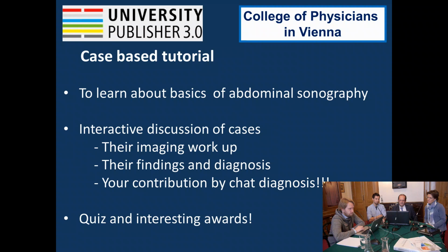Well, interactive discussion of cases: we will concentrate on the imaging workup of findings and diagnosis, and especially on your contribution by chat, diagnosis or any kind of question or idea you have about these cases. Just share that with us over the chat.